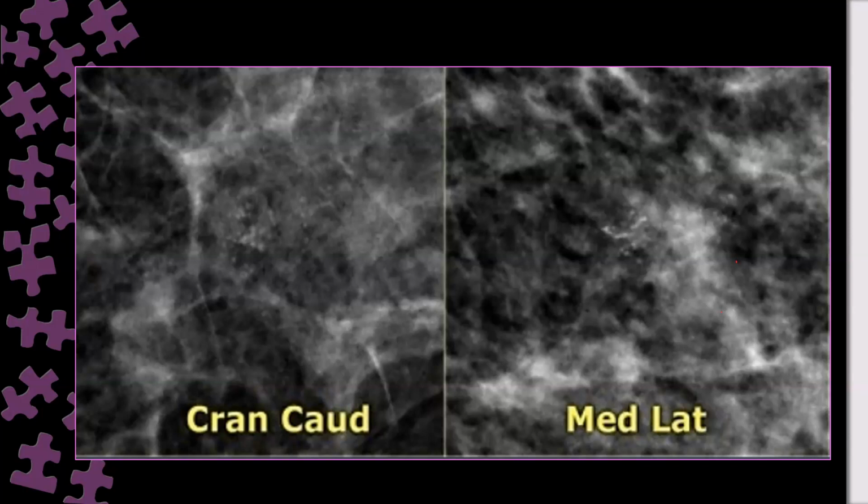That is the layering of milk of calcium. That is why, in the latest or the coming editions, they change its name to layering calcifications. Since it changed shape, this is the effect of gravity, because it is milk of calcium in a microcyst. This is common; you will see it every day. Go and open the bags and you'll see a lot like this.